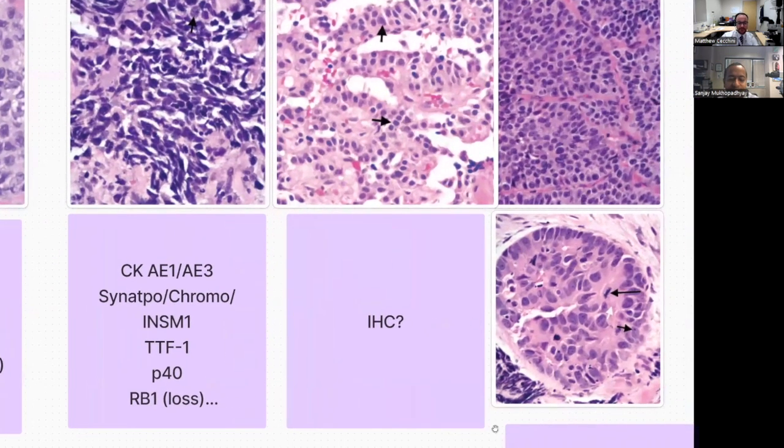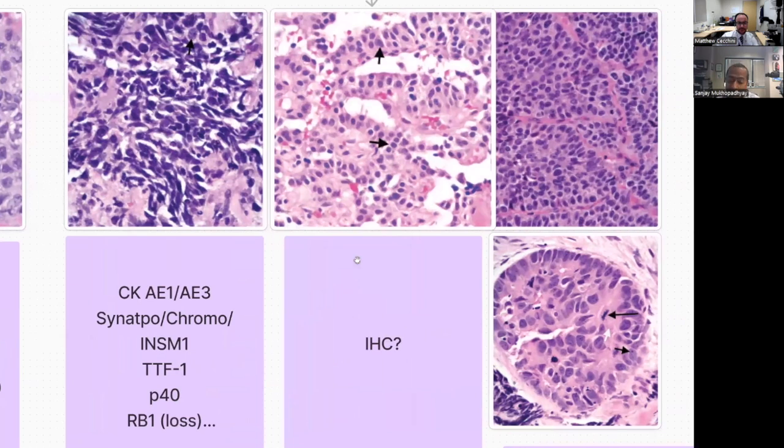So what about a lower grade neuroendocrine tumor on a biopsy, something in the carcinoid spectrum? I think this is also not a clear-cut situation. Like the small cell, if your clinical setting and morphology is perfect, the yield of immunos is so low. In a case that has great morphology like this, a youngish person, never smoker, with a solitary small nodule, I think it's very, very likely to be carcinoid, and you don't need to necessarily do any stains. And on lobectomies, I don't do the stains.